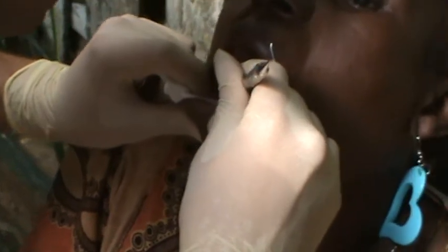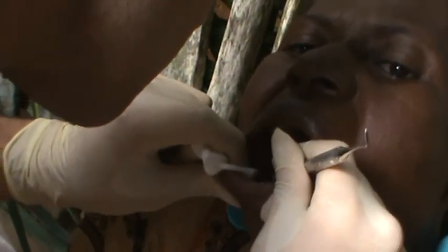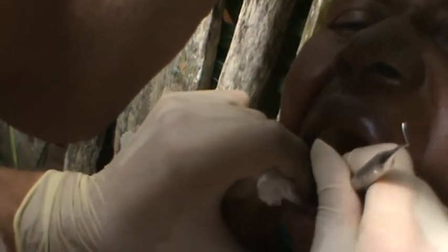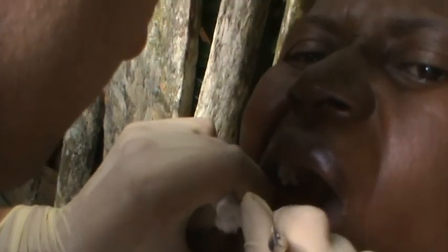It's okay, it's okay. Madam, if it hurts, do a hand gesture. There's Alex. You're going to feel the pressure when he's working.